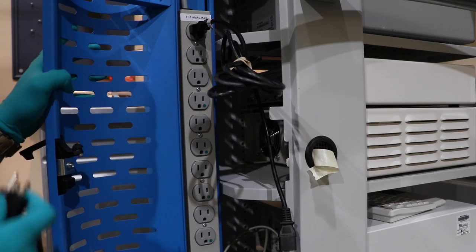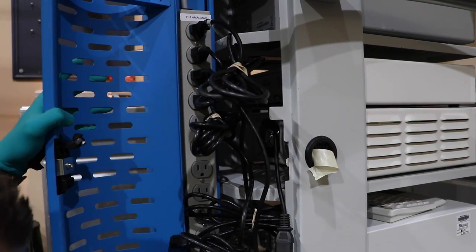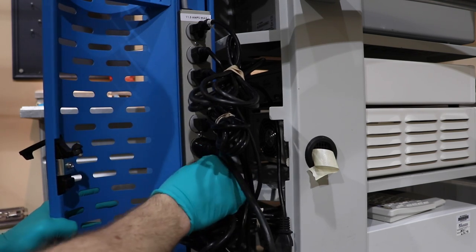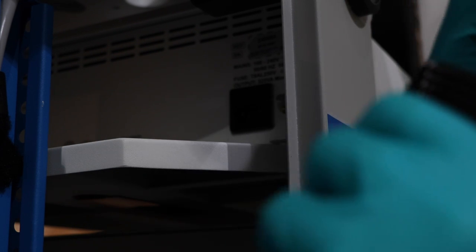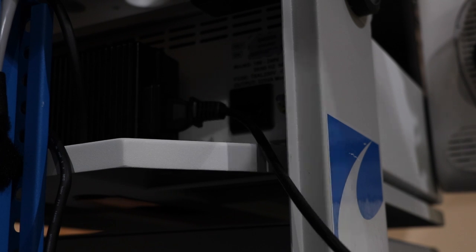Okay, so first we're going to take all of our power cables and plug them into the tower. Let's go ahead and plug in our power supply for our VP4726. We'll take that cord and feed it through the top of the tower.